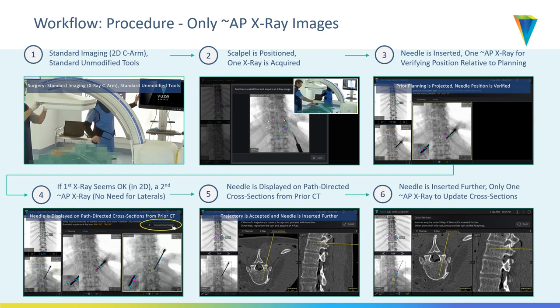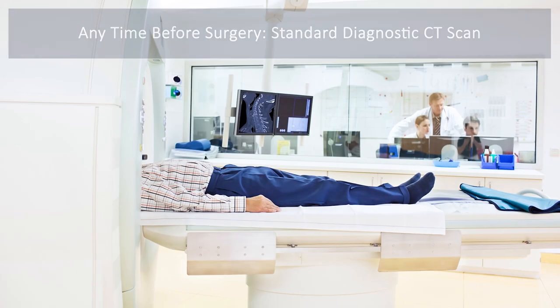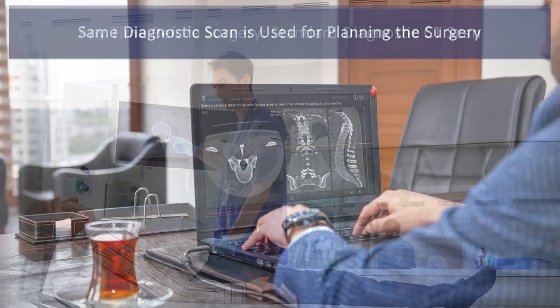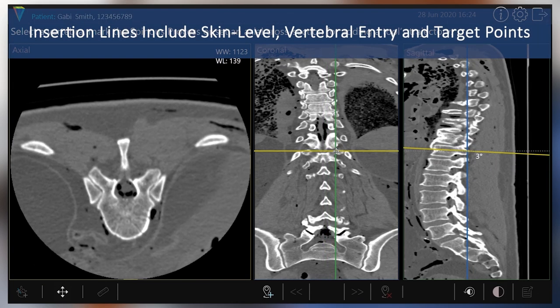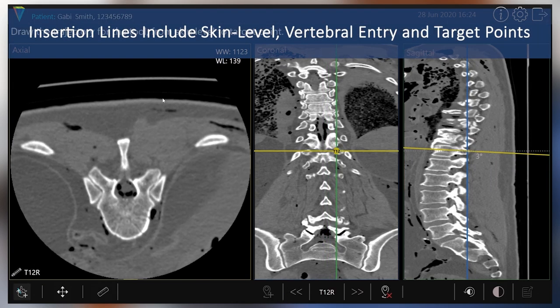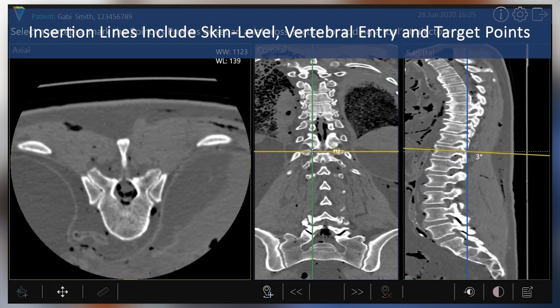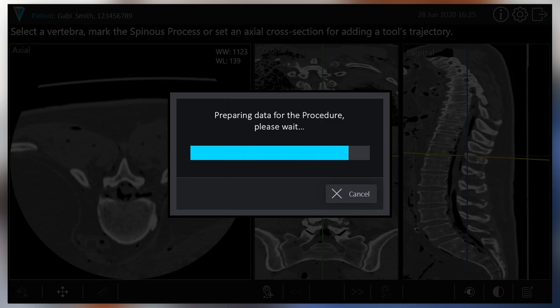That's the workflow in discrete phases. Now here's the three-minute video describing the operation. Regular CT scan, supine position. This is the planning — same laptop now also runs the Views procedure. Very minimalistic planning, just drawing the insertion lines. You can simulate screws or rods if you want, but the minimum is drawing the insertion lines — skin level, pedicle entry, target point — automatic measurements produced by the system. You're done with the planning.